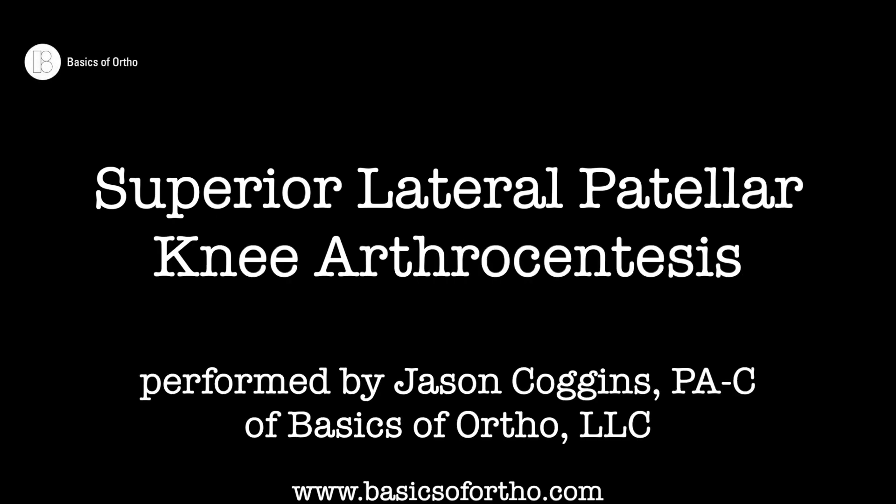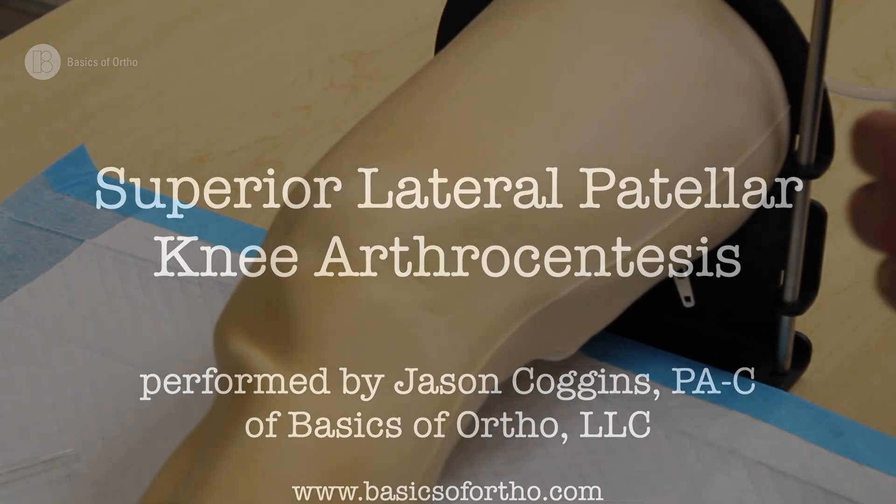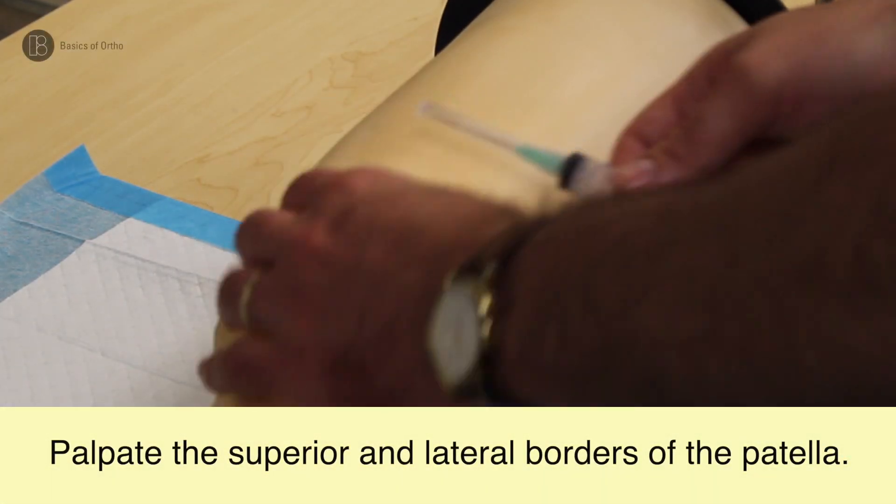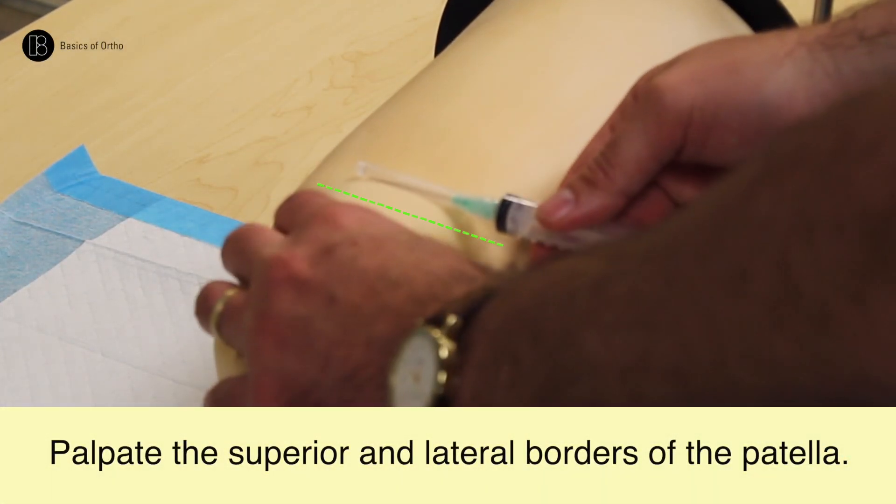This video will review the superior lateral patellar knee arthrocentesis. To begin, palpate the superior and lateral borders of the patella.